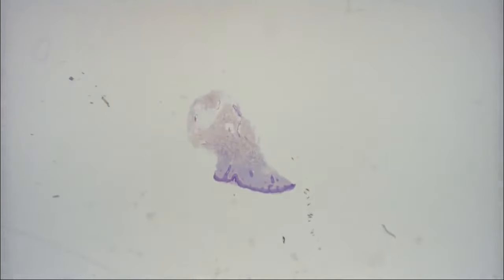Show a clinical photo if you'd like. So this probably is sort of what this lesion might have looked like clinically. Most people don't biopsy psoriasis when it looks like this unless they just like biopsying patients for fun. So they usually biopsy lesions that don't look like classic psoriasis. That's where we have to sort of work at making a diagnosis. Okay, the next case.